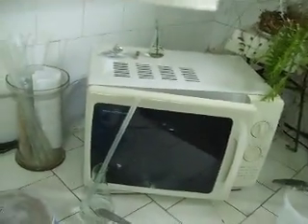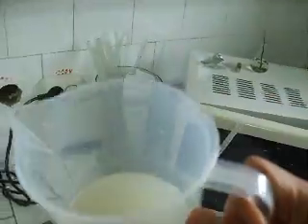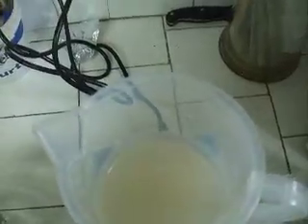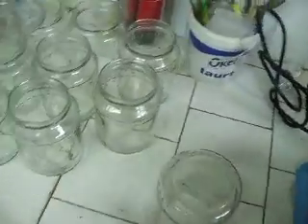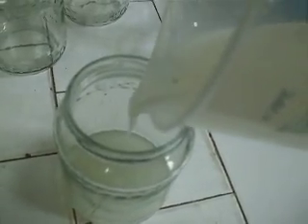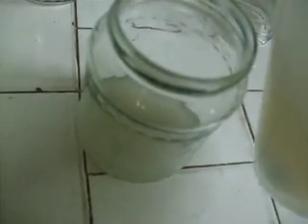So this was dissolved in cold medium, 20 grams per liter. There are 500 milliliters, here I added 10 grams. So this is it. Now. Excuse me, I'm maneuvering with one hand and filming with the other. It goes approximately like this.